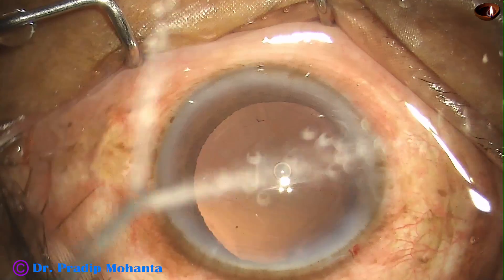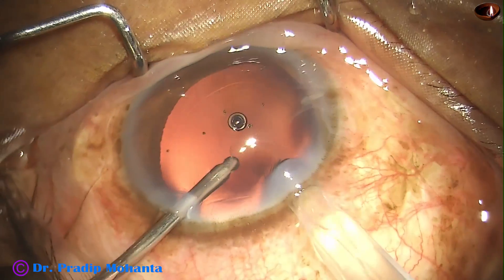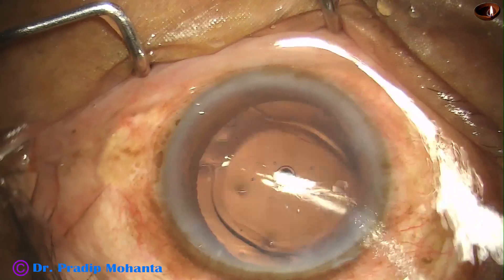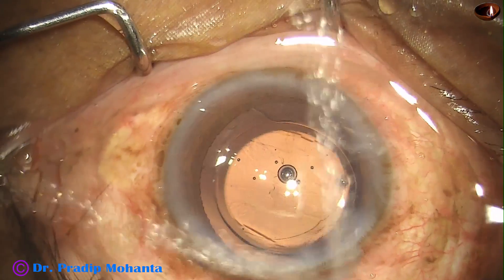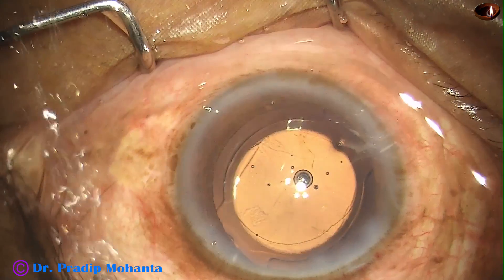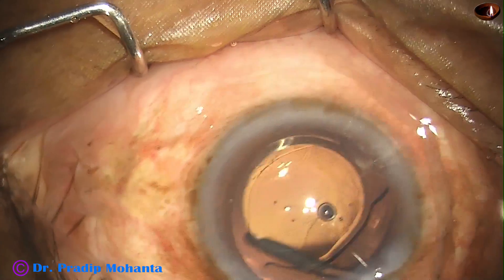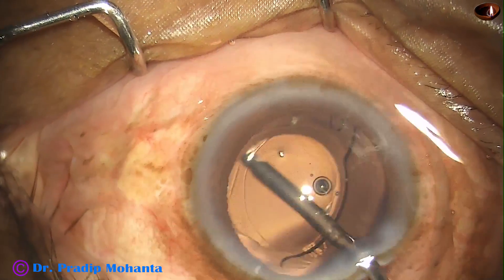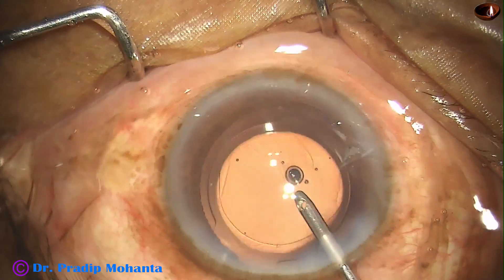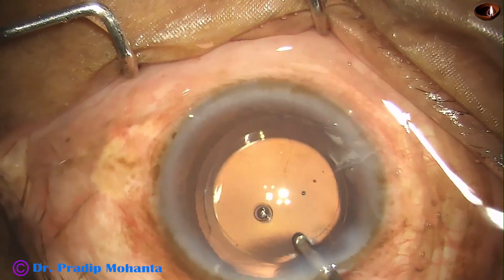And now this is a foldable intraocular lens going into the capsular bag. Yes, it has gone into the capsular bag. This is further polishing of the posterior capsule and removal of some viscoelastic that was in the lumen of the cartridge.